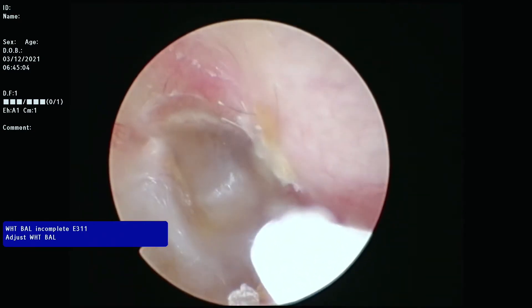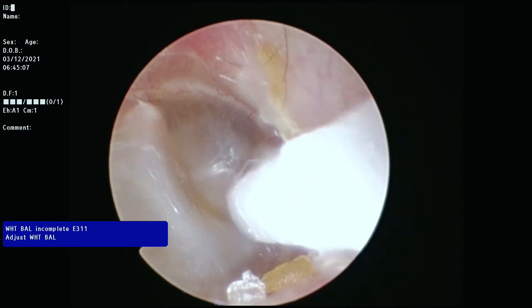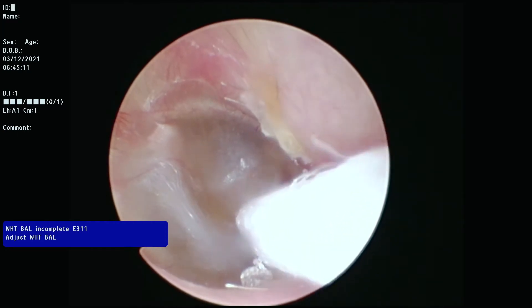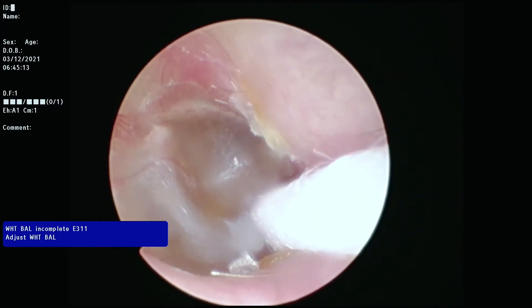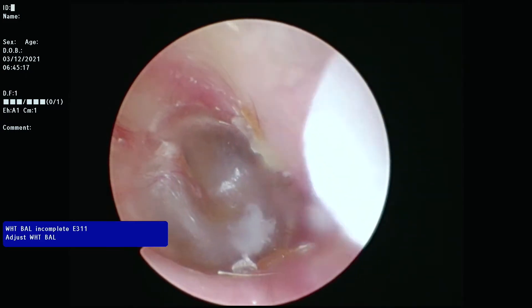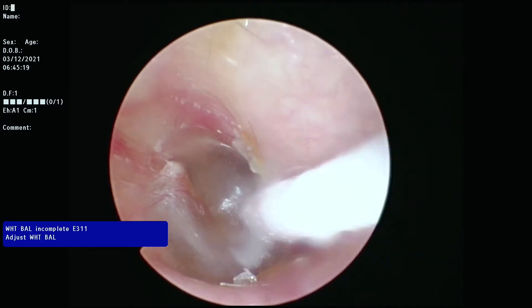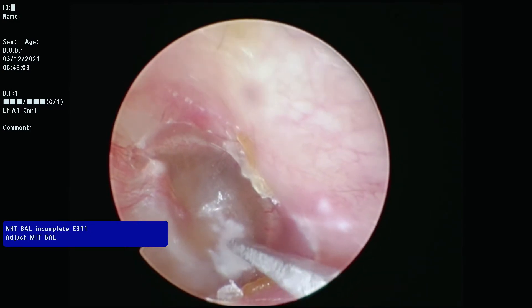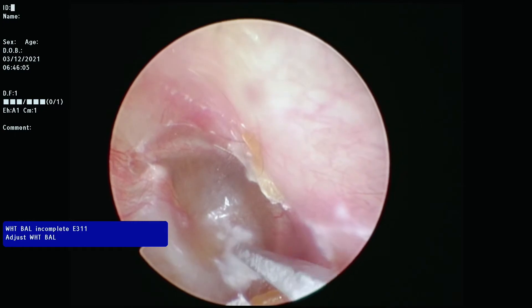Now I am applying a topical numbing agent called phenol to the eardrum. The next step is a myringotomy, where a small blade is used to make an incision in the eardrum.